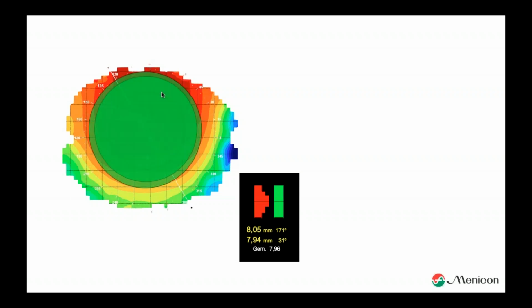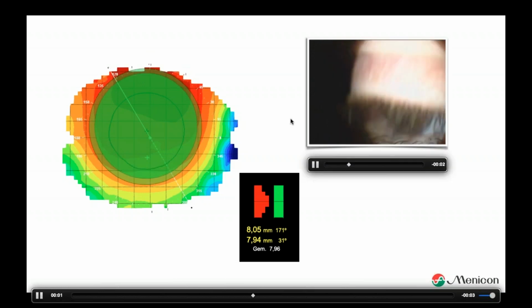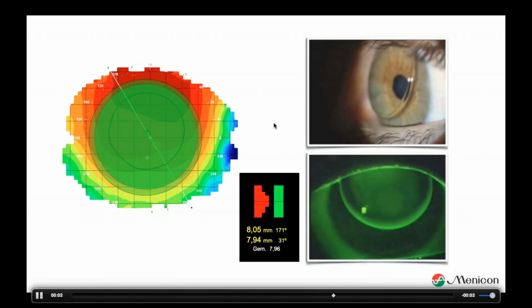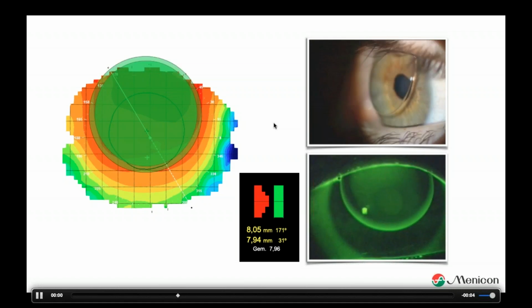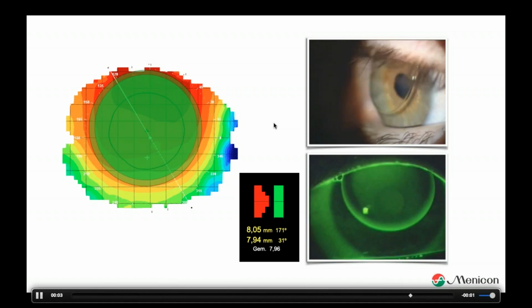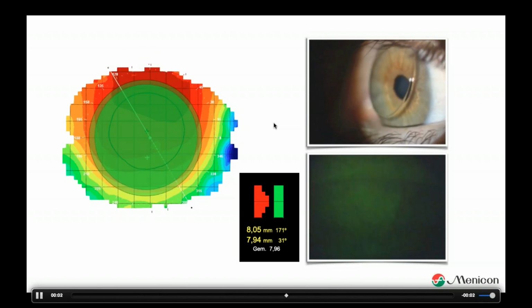Let's say we put a lens on the eye, it will go superior. And on this eye, actually, I put some lenses. This lens will be superior, and this is superior as well. And the fun thing is, a lot of people call this a high riding lens. And honestly, I'm arguing with that, because I learned at school that a high riding lens is one that is decentered.